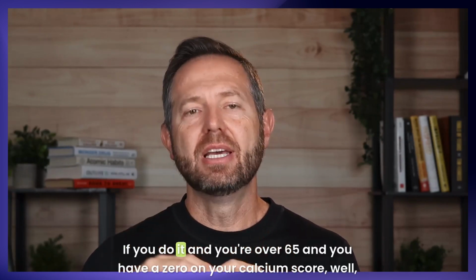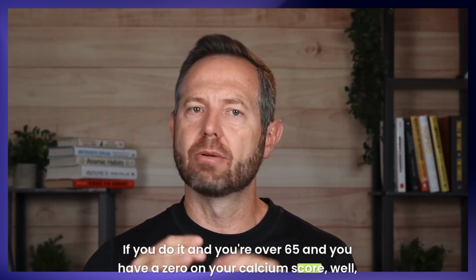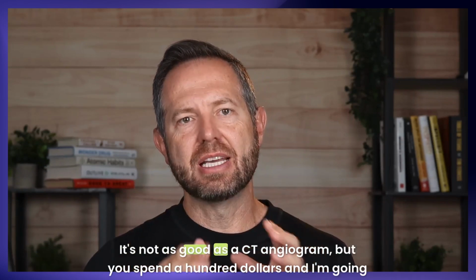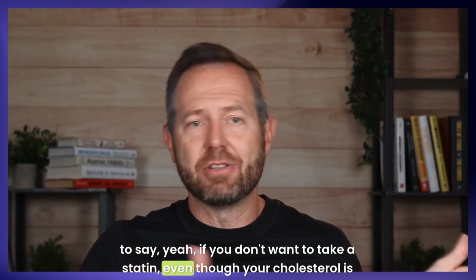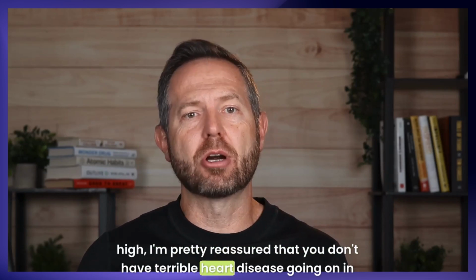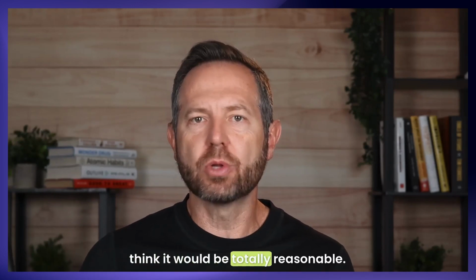If you do it and you're over 65 and you have a 0 on your calcium score, well, holy smokes, I'm super reassured. It's not as good as a CT angiogram, but you spend $100 and I'm going to say, oh yeah, if you don't want to take a statin, even though your cholesterol is high, I'm pretty reassured that you don't have terrible heart disease going on in there. So there is a time and a place where you could choose to do a calcium score, and I think it would be totally reasonable.